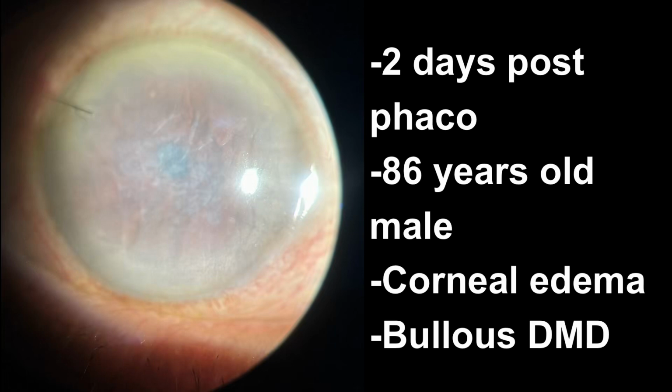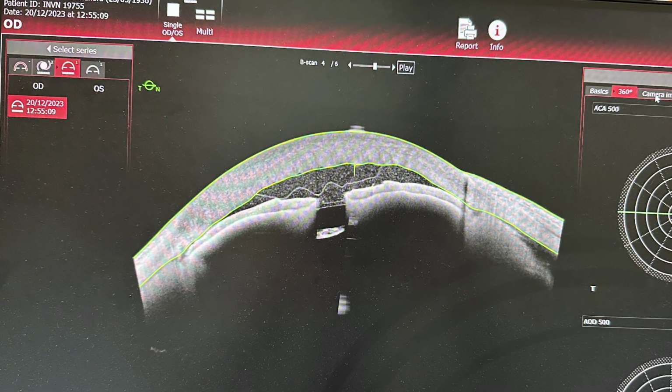Hello everyone. In this particular case, I want to demonstrate how I managed a case of bullous DMD in an 86 year old male who was referred to me for corneal edema management 2 days after cataract surgery. So you can see in this ASOCT picture which shows shallow AC along with bullous Descemet membrane detachment.